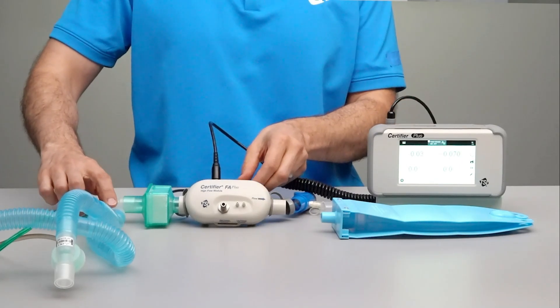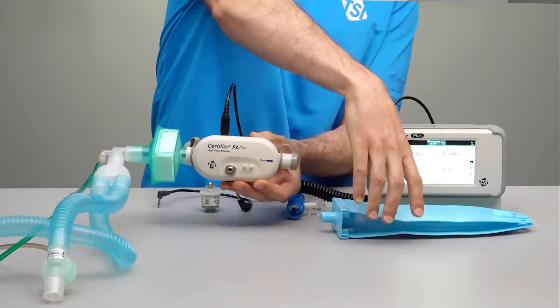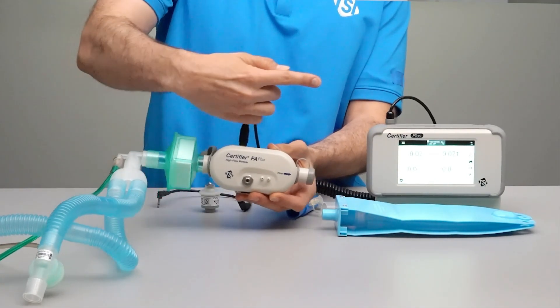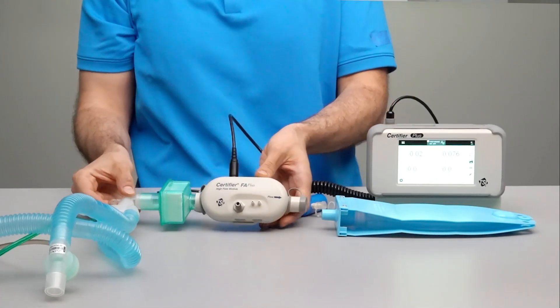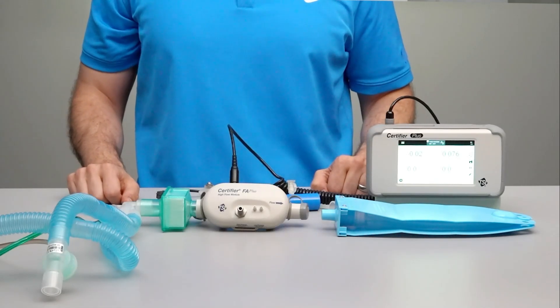For a unidirectional test setup, the Y fitting would be placed after the flow module, between the flow module and the test lung. With this test setup, only the inspiratory flows would be measured by the Certifier and the expiratory flows would be diverted from passing through the Certifier instead and would vent to the atmosphere.